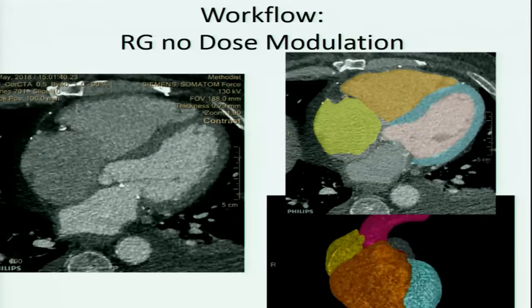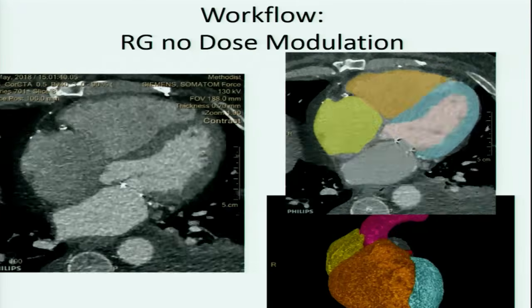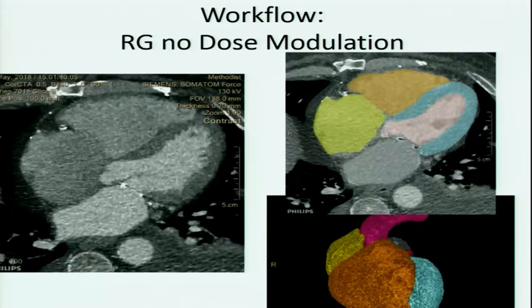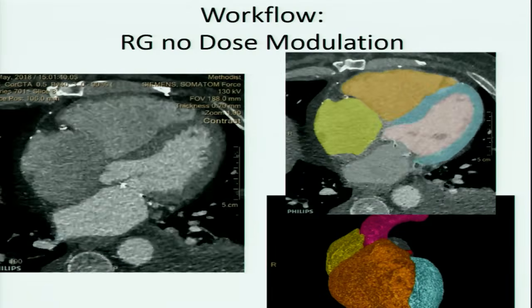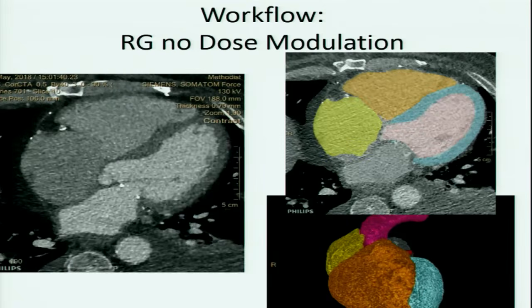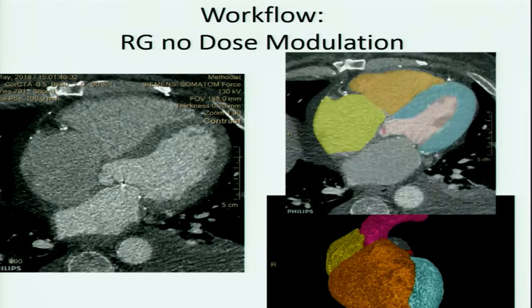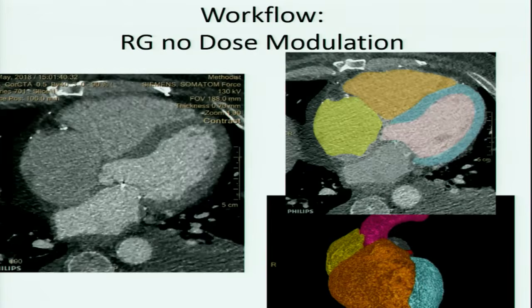Usually, if you're doing the threshold-based method, it's going to basically ignore the papillary muscles, right? Depending on how the software is designed, it only follows the border. Yeah, into all the crevices. Yeah, exactly. So we cover the papillary muscles also.